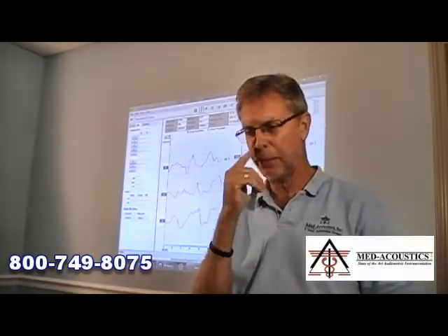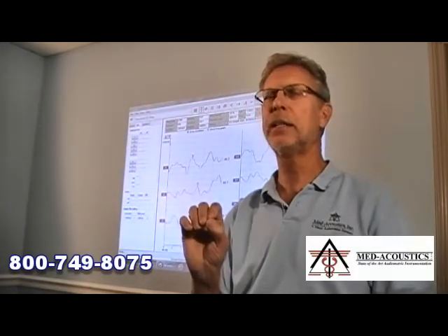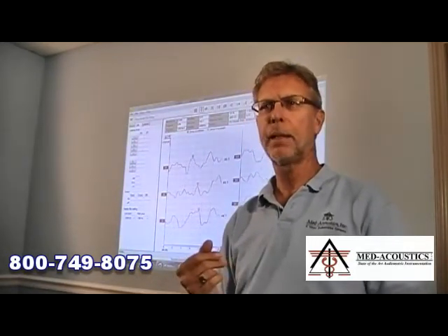Let me show you, for example, one thing this has is chirps. Now, the chirp stimulus is unique to products that are in the family of products owned by a company called William Demant. Okay? William Demant owns Grason-Stadler. They own Interacoustics. They own Maico. They also own Medrx and Micromedical, Oticon, and many other companies. Okay? Radio Ear. And they have a patent on this stimulus, and it is called the chirp stimulus.